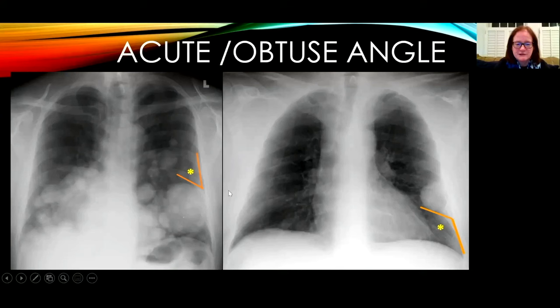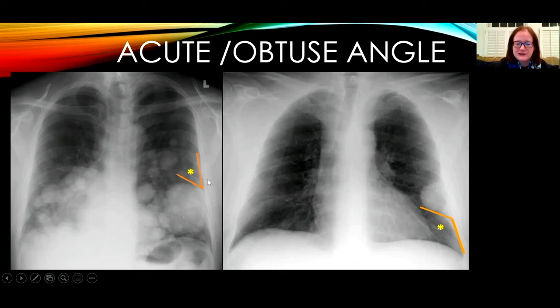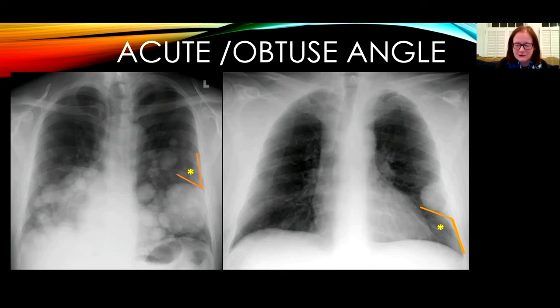Here are two chest radiographs. On the left, a patient with metastatic renal cell cancer and cannonball metastases — the largest lesion makes an acute angle with the chest wall. The patient on the right has a solitary plasmacytoma in their left chest wall, and this makes an obtuse, larger than 90-degree angle with the chest wall.